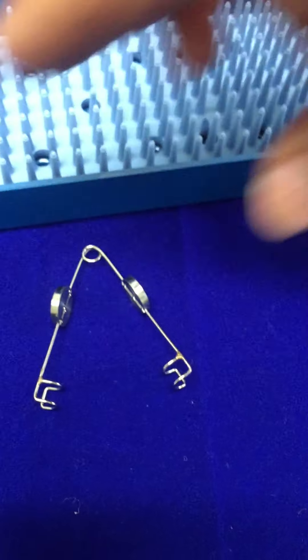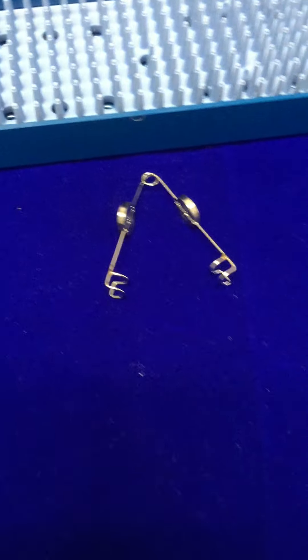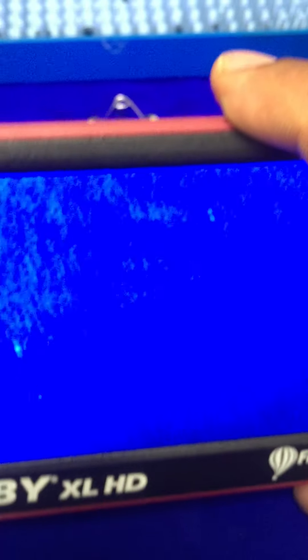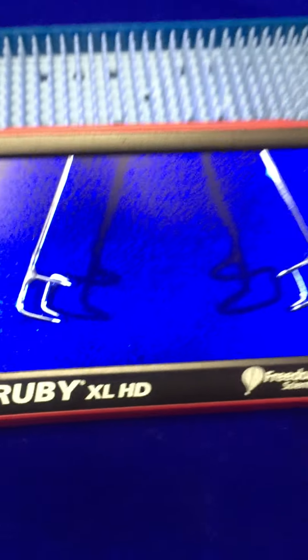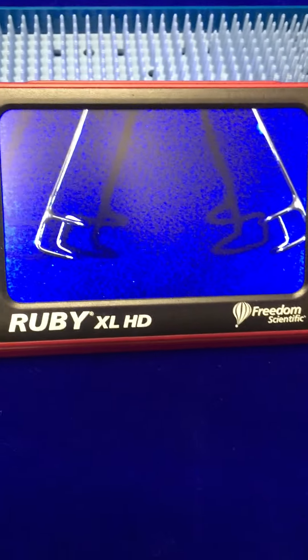Now let's look at the speculum under higher magnification so that you can see how it looks.